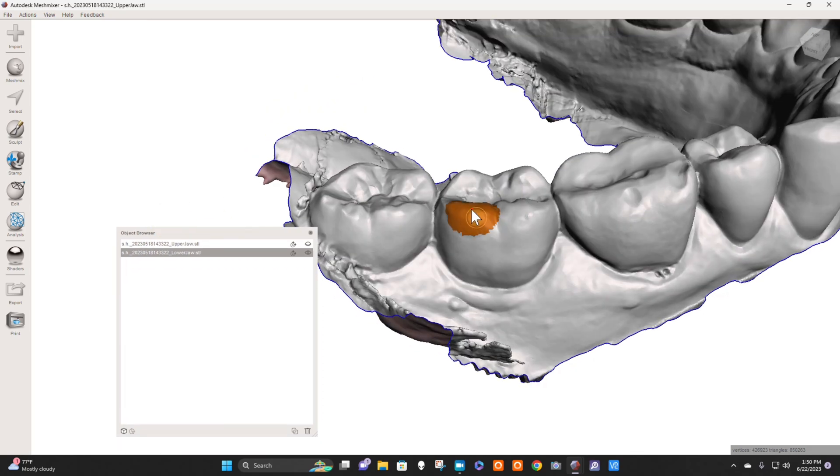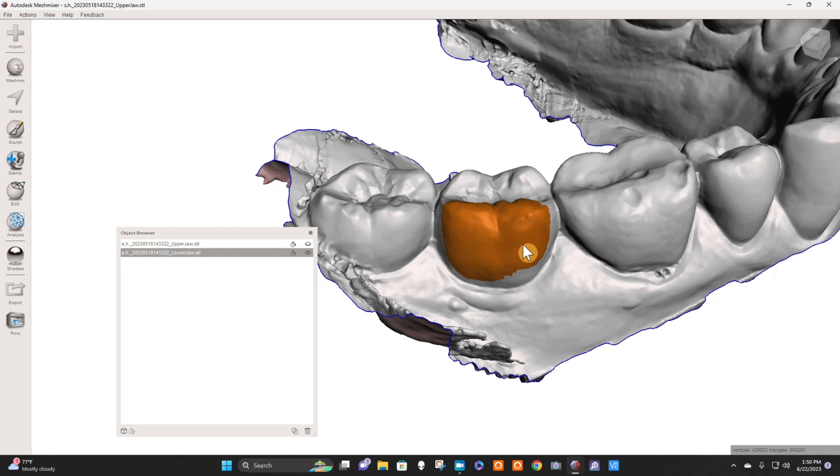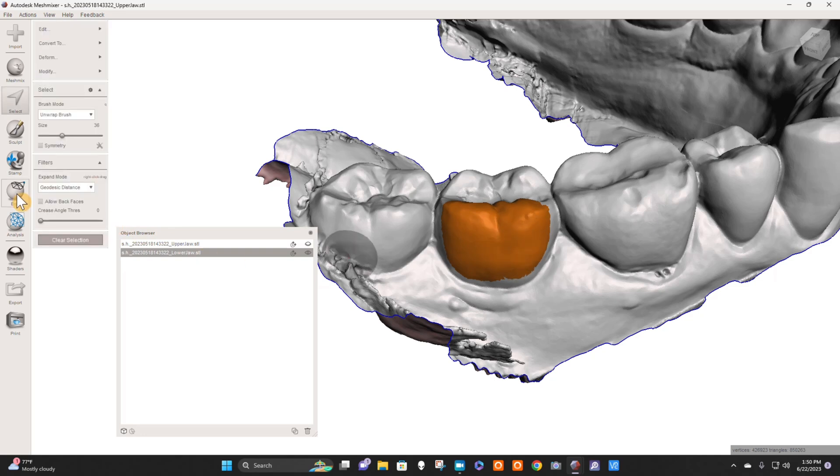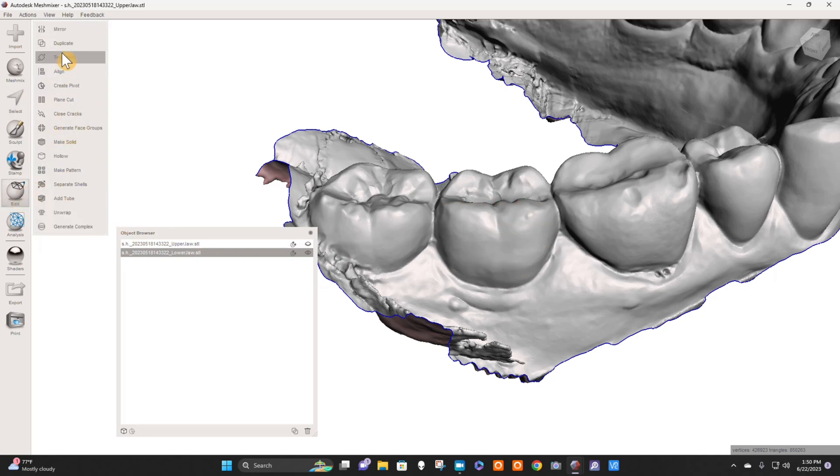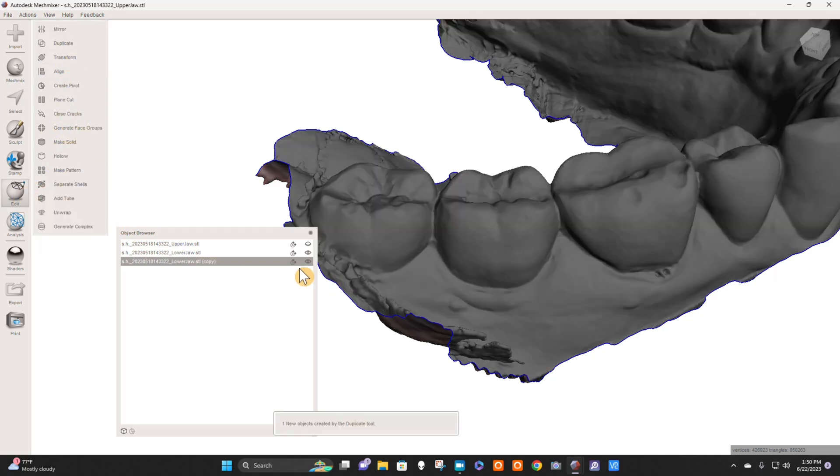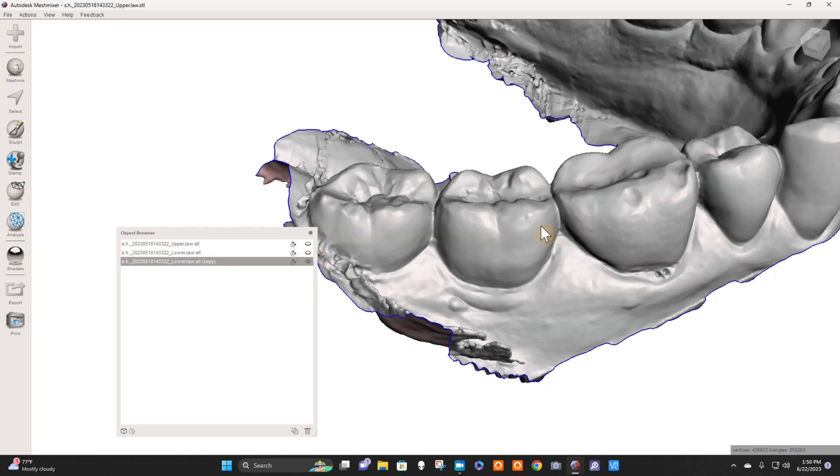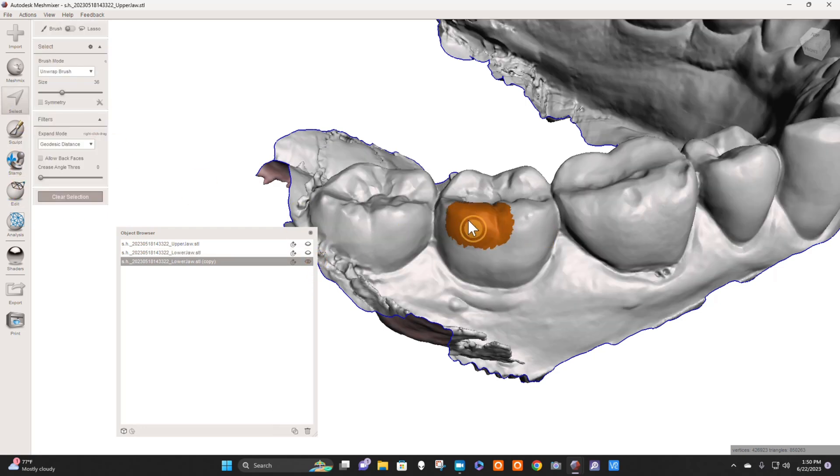There's like a million ways to do this. We're going to first go to Edit, Duplicate this model so we have a backup. And now I'm going to select this tooth.